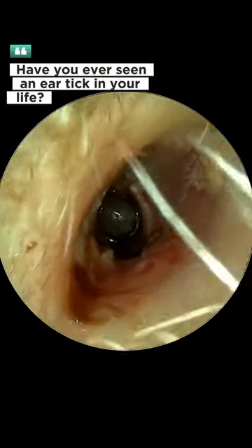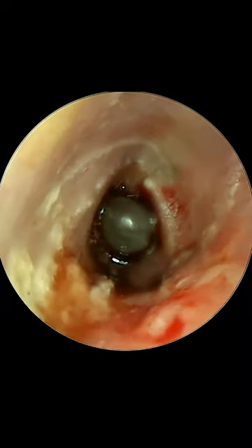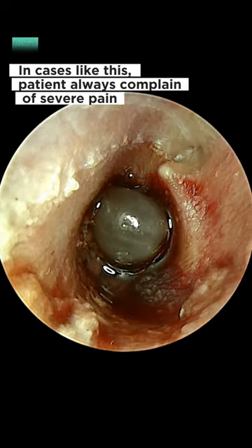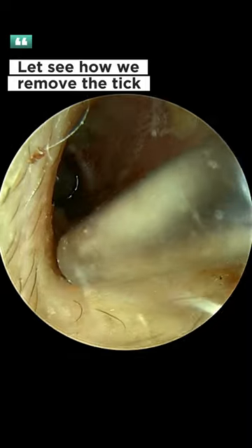Have you ever seen an ear tick in your life? This video will blow your mind. This tick sucks on our patient's blood on the eardrum. In cases like this, patients always complain of severe pain. Let's see how we remove the tick.